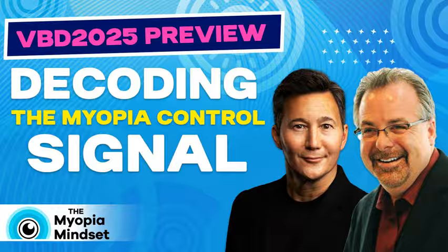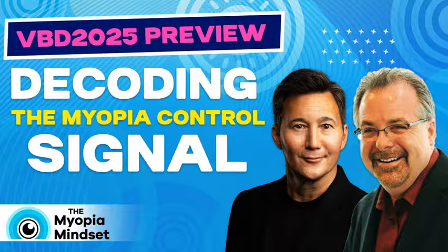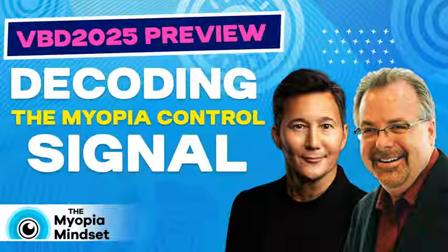Well, the lecture is really going to be focusing in on how we can modulate the myopia control signal to the child's eye. You know, back in the old days, Matt, it used to be we would do orthokeratology on a child and just that was it, with the myopia control treatment. They either responded well or not. And the results of the studies showed that we could control the child's myopia to a degree of around 50%.